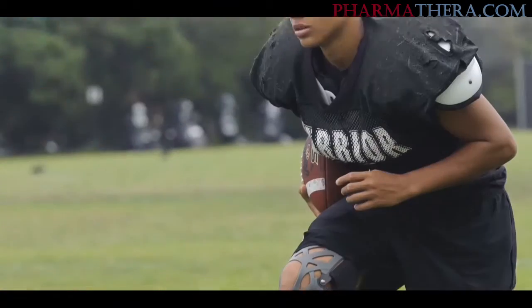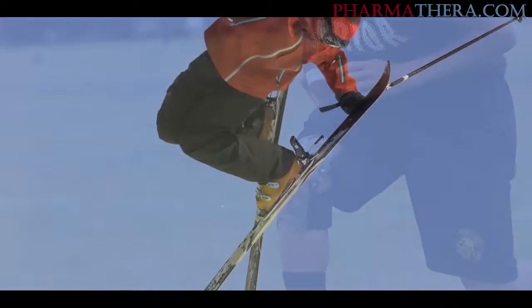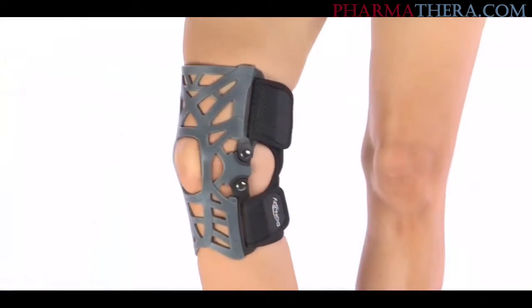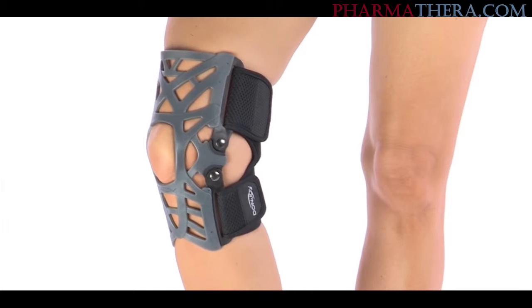Used by professional football teams, Olympic ski, snowboard, and volleyball teams, the Reaction Knee Brace is now available to anyone who suffers from knee pain.